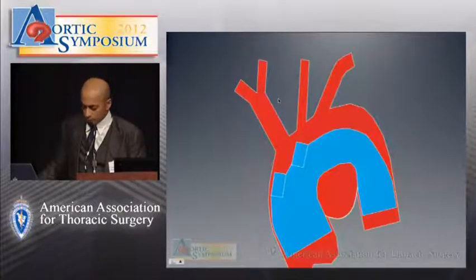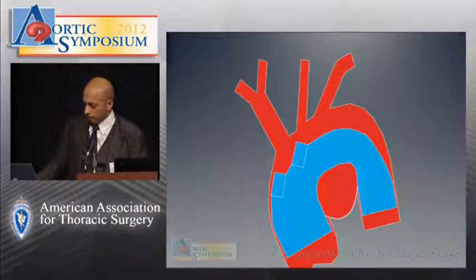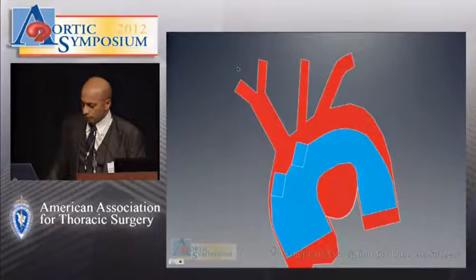So here's what I really want to speak to you about is the branched technique. Again, we had such success with the thoracoabdominal branch grafts that Roy will speak to you about tomorrow. But with this, the principles are fairly straightforward. You deploy the branch graft, you come from the right arm, catheterize the branch and extend from the branch into the innominate artery. On the left side, you have a carotid subclavian bypass, which you access from the left arm, go up the carotid subclavian bypass, down the left carotid, and catheterize the branch for the carotid, and then extend this with a covered stent.